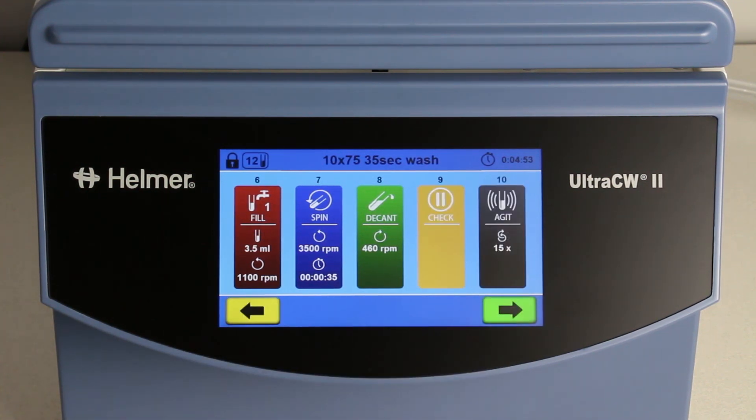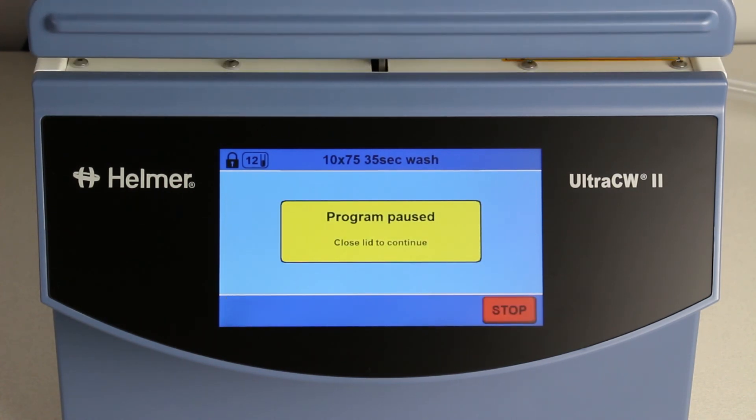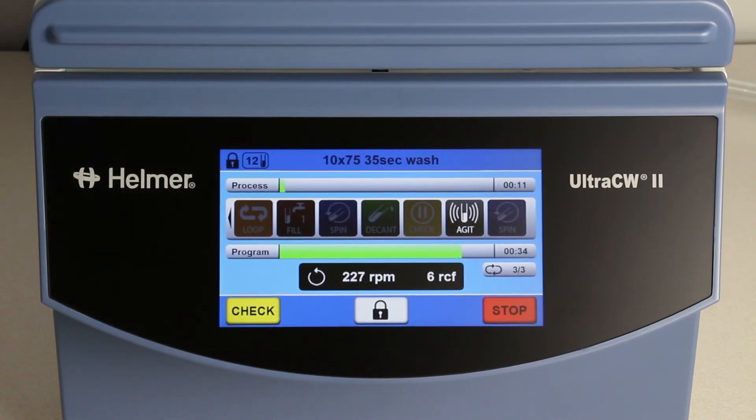Then, there is another fill, spin, and decant. Then, there is a check step. At this point in the process, the lid will open to enable the addition of reagents at the correct point in the workflow. When the lid is closed, the program will resume with an agitation step and then a quick spin at the end.